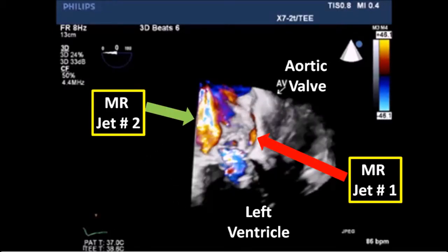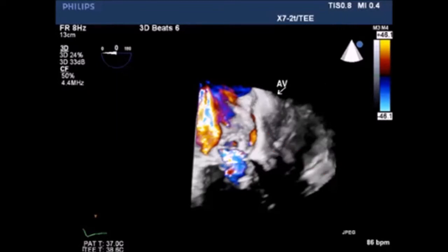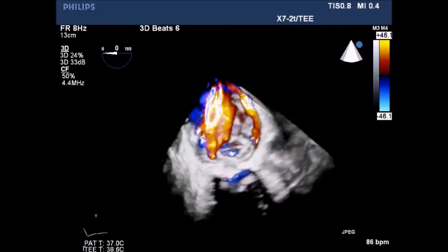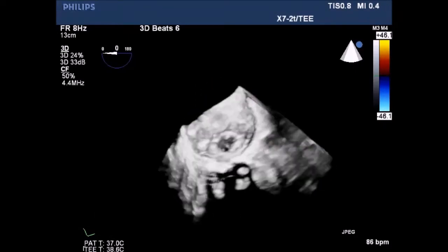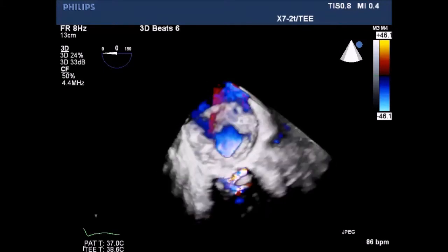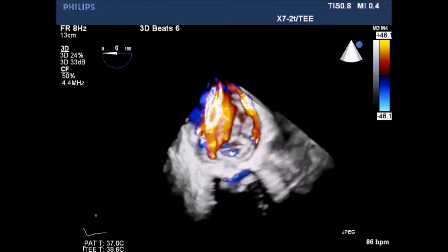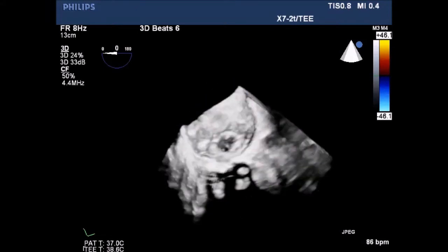The image is rotated further — now MR jet 2 is on the left side of the screen and MR jet 1 is on the right side. We continue to rotate the image to see clearly both MR jets. Both were, as noted, paravalvular leaks. Here we can clearly see the two mitral regurgitation jets.